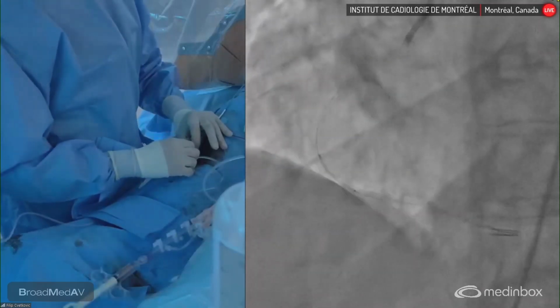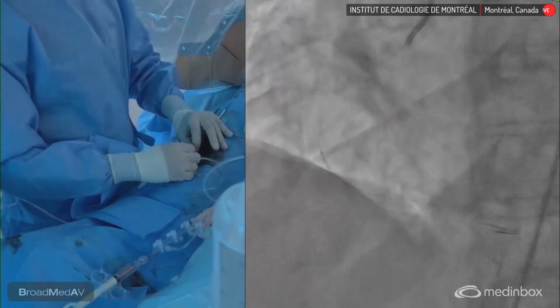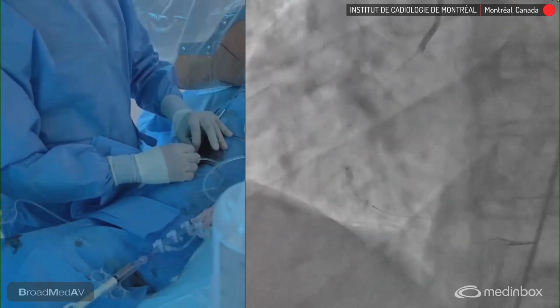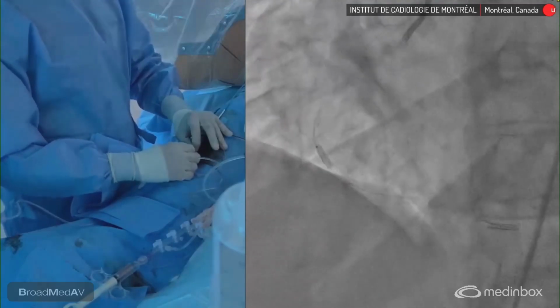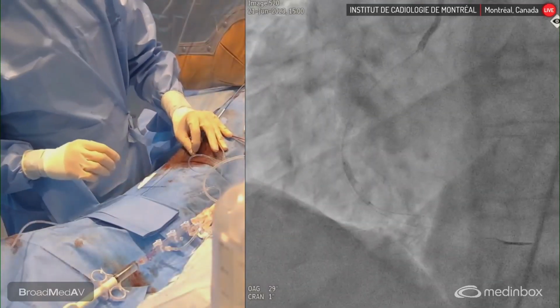3.0, so we'll go softly. Probably stronger radial strength. I think we're good here. Yeah, we'll go softly because I'm not sure of the size of the PL. We haven't gone yet with the. All right. Okay, so 6. That was good. Let's pull back maybe.